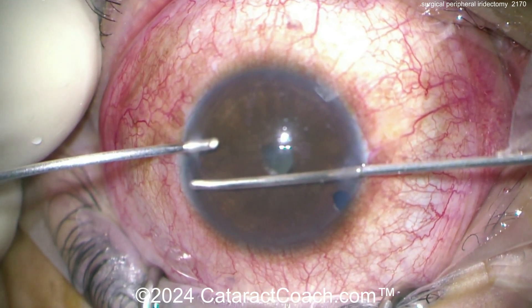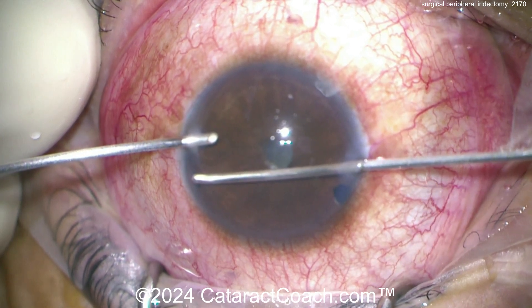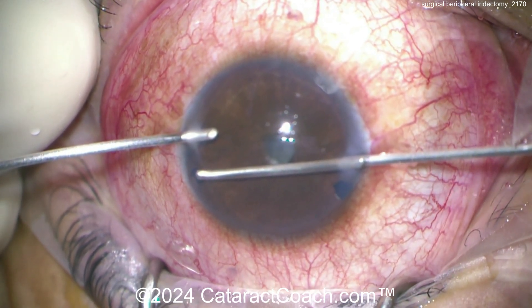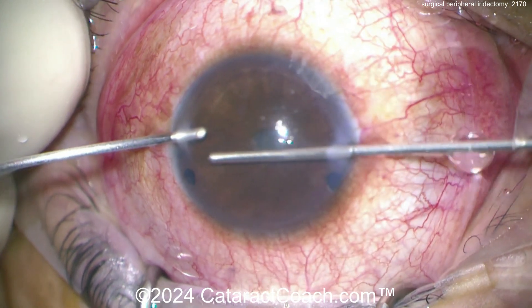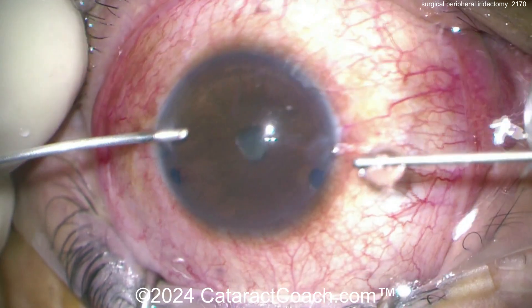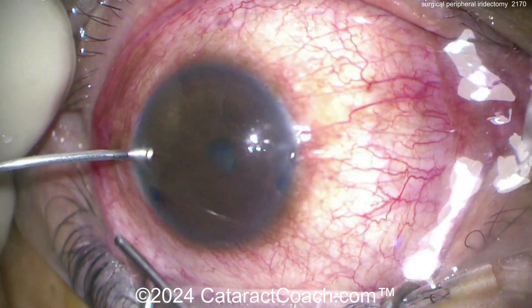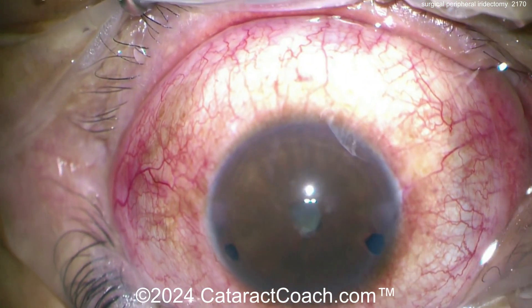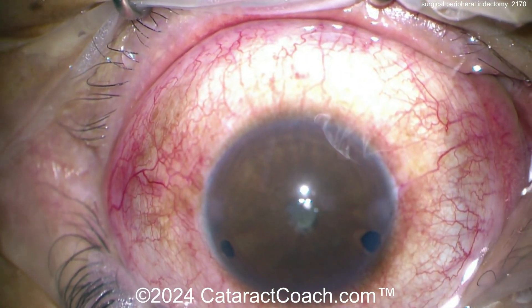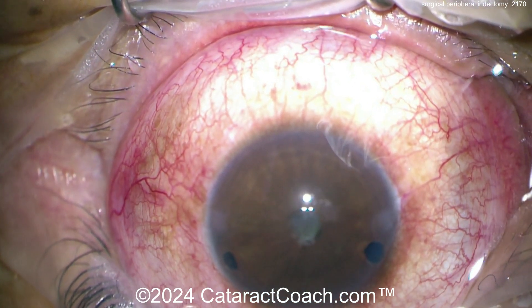Why do this instead of a YAG laser peripheral iridotomy in the clinic? You can do either, but in some cases — like the first case today — the eye is too inflamed and the cornea is too cloudy. You can't get the laser to actually penetrate the iris tissue. In those cases, use these surgical approaches. With two small paracenteses, these seal up very very easily.